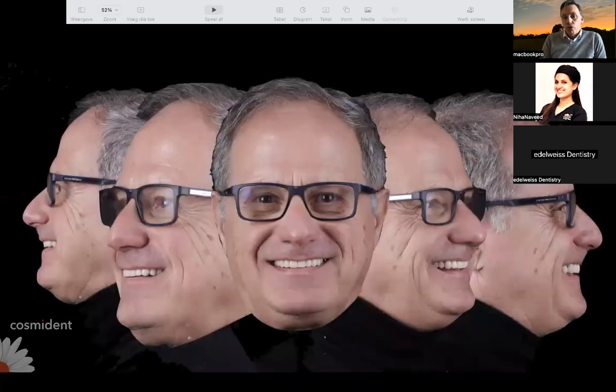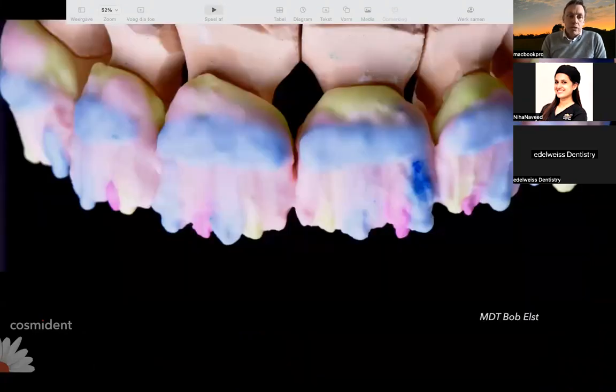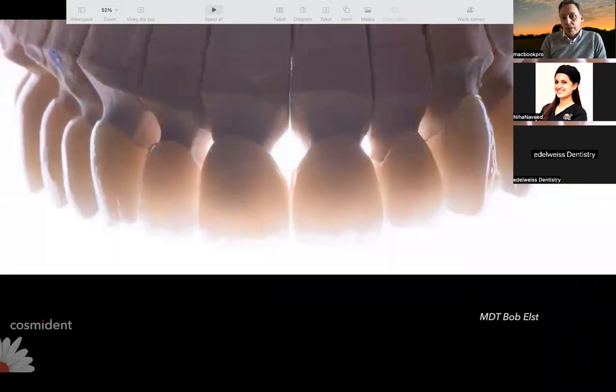I will show you now. Here you see them. These are temporary zirconium restorations. We check once again the occlusion, and if everything is okay with the patient after a few weeks, we finally change them to the final restorations with porcelain on top. But the whole procedure takes us a lot of time, like you can see.